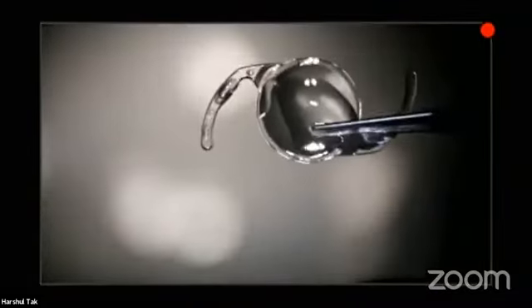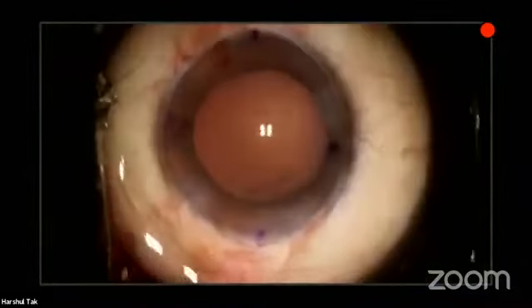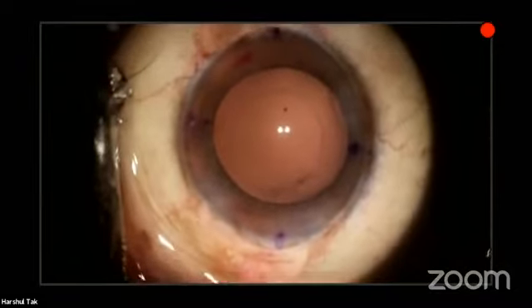I'll show you, it has toric marks here. You can see these two lines are there. It comes with this butterfly cartridge, so you need to load it like a baby, and it's ready for implantation.